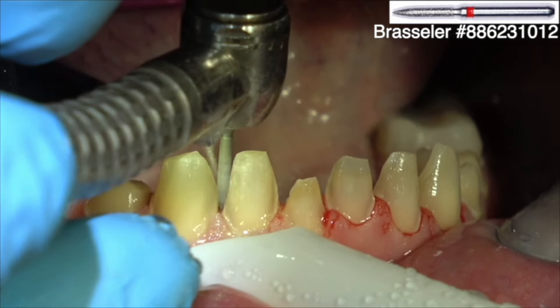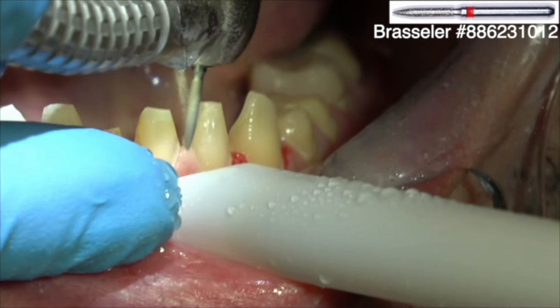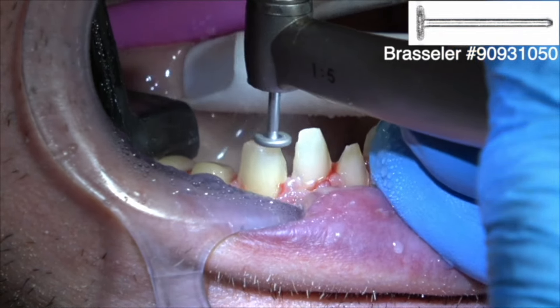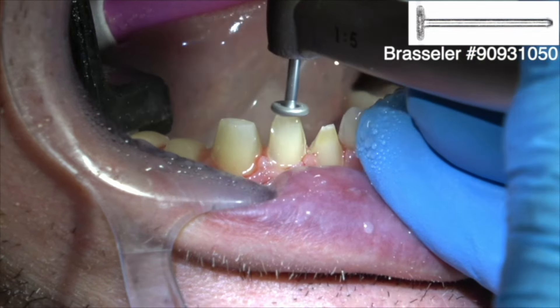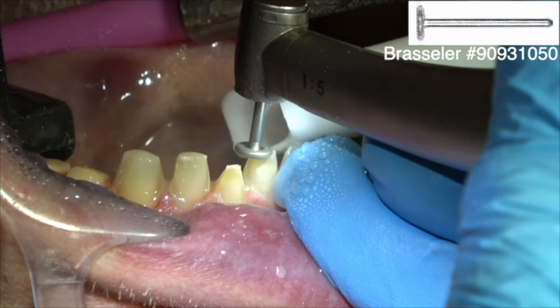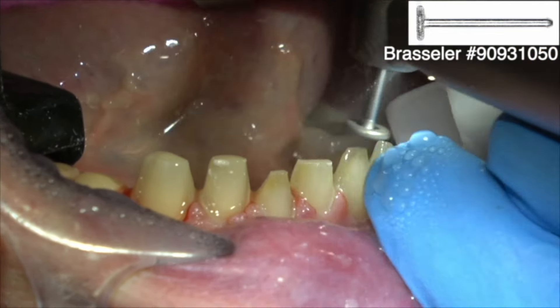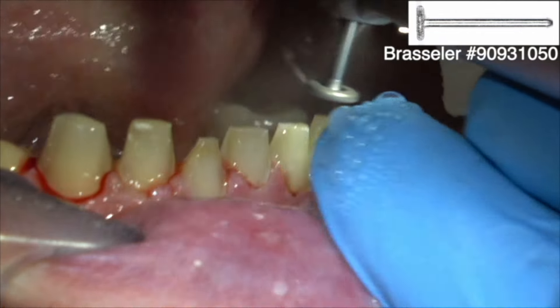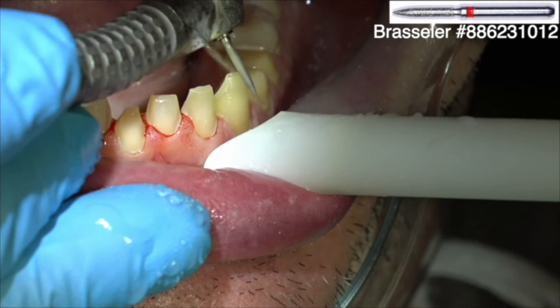We're trying to have at least 6 tenths of a millimeter of preparation at the margin if possible. If there's not some depth to the prep, it's hard for the technicians to read. Sometimes all you can use is a flame-shaped diamond. I'm looking at the patient from the front, face on, to be sure these incisal edges are parallel to their pupillary line.